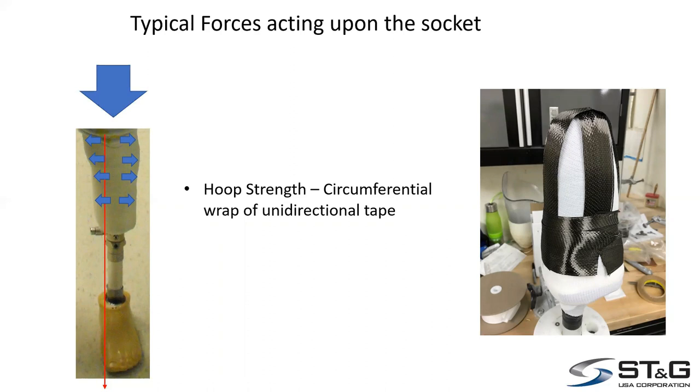And also, you'll see in the picture where we have the struts. When you get this intersection of the hoop and the struts, you get the 0-90 degree effect of the fibers laying on top of each other, and you get a lot of racking prevention, where it prevents moving back and forth and also deflecting, because you have a very strong 0-90 reinforcement layer.